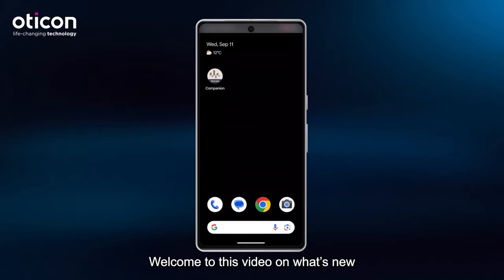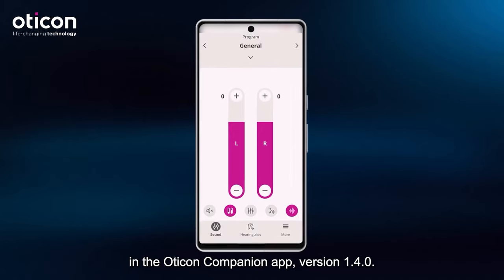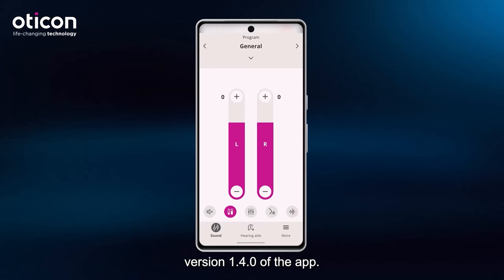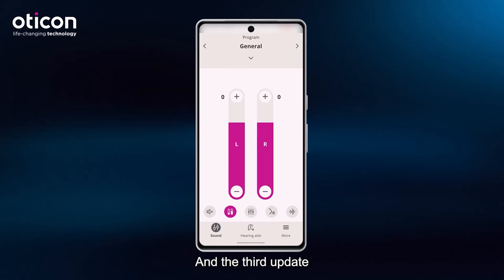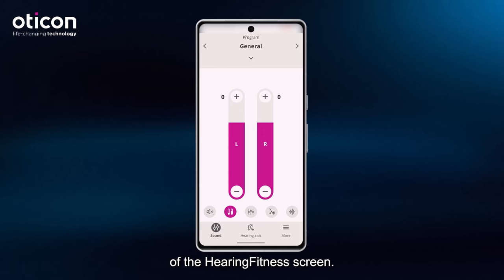Welcome to this video on what's new in the Oticon Companion app version 1.4.0. There are three updates to version 1.4.0 of the app. The first update is regarding the program selector. The second update, which applies to Android only, is the Keep Connection update. And the third update is to the monthly view of the Hearing Fitness screen.